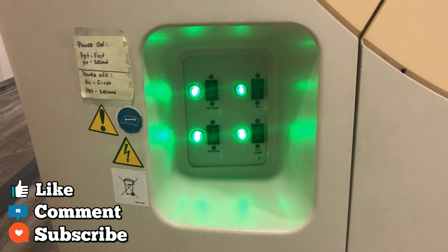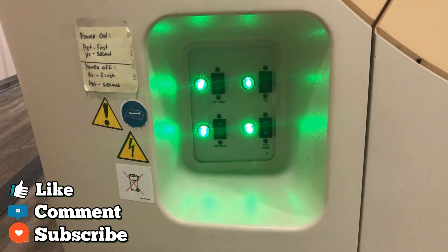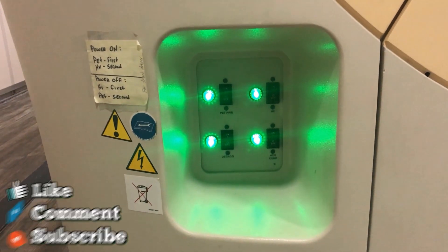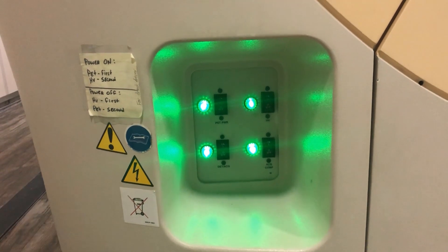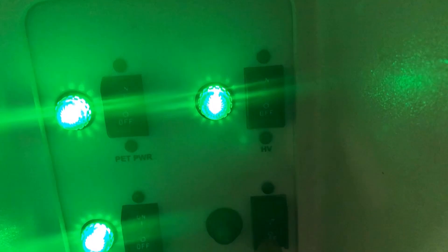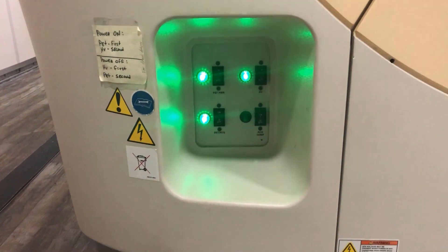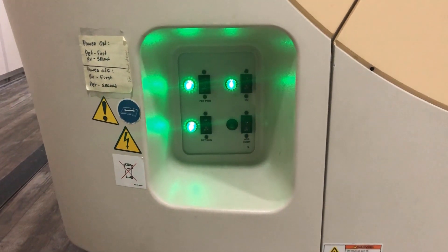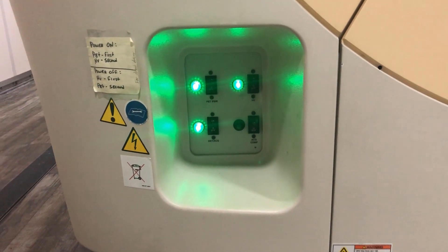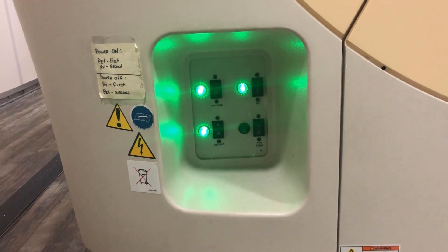Next, we're going to come to the back of the gantry and turn the ACQ comm switch off. That should be the bottom right. And we're going to let this sit for about 30 seconds to 60 seconds.